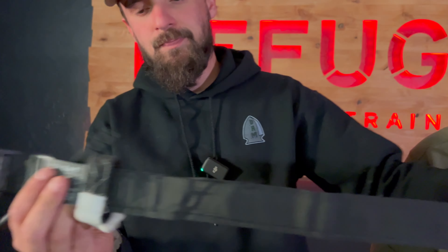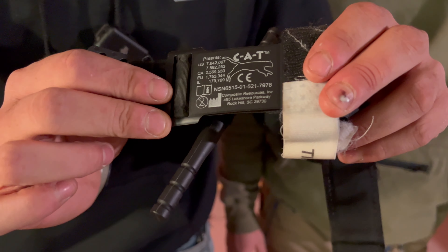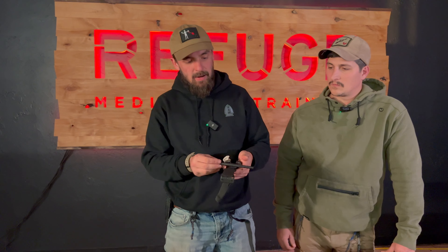Looking at the final tourniquet on the table — this is where it gets a little interesting. This one is actually a genuine CAT tourniquet; it's a Gen 2 CAT. It's a little bit shorter and the windlass was made a little differently, but it still has great materials.